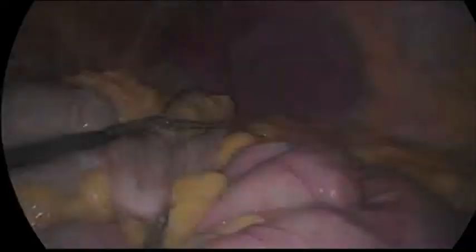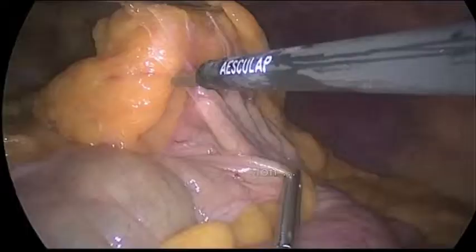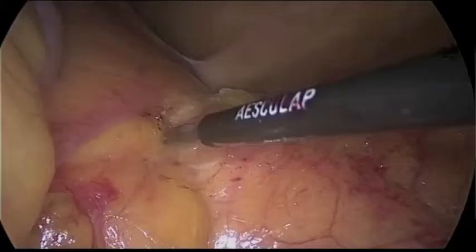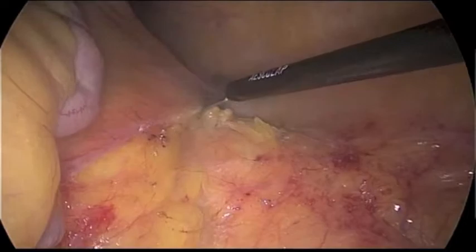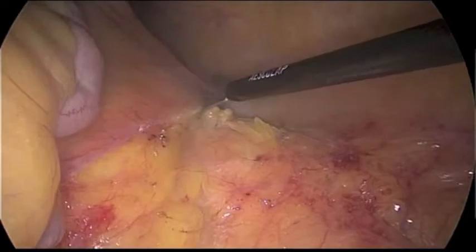We then mobilized the transverse colon, entering the lesser sac and removing the omentum from the transverse colon. We continued the dissection laterally, freeing up the splenic flexure, continuing to march down towards the descending colon.